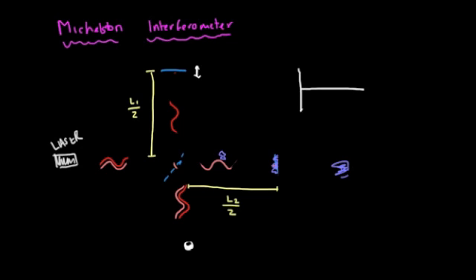And I'm going to draw this as orange. That is an exaggeration. It's not orange, it's just a little bit off of red. So what if we include light that isn't perfectly red? So this is our first red light, and then this is orange. So remember, with orange light, the wavelength is a little bit shorter.